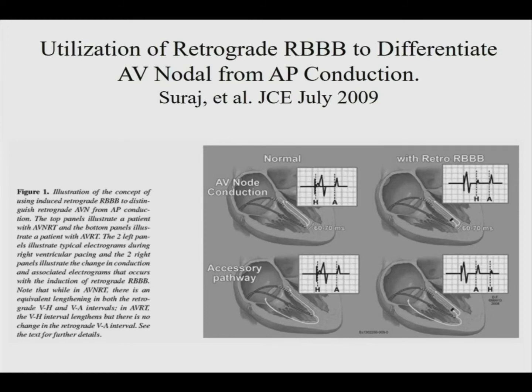Just imagine you're looking at an EKG like we did at the beginning. What happens during the tachycardia that might be useful? Bundle branch block. If you get a bundle branch block, that alone can be useful. It can also affect the intracardiac timing. And so if you have a bundle branch block and it changes the VA interval, that can be diagnostic, right? What other things can happen?